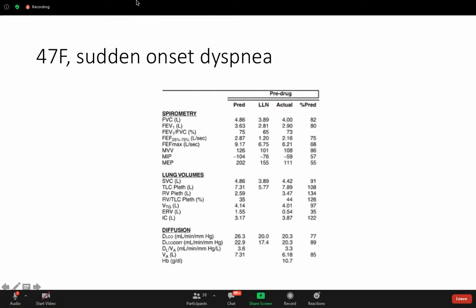Doctor, peace be upon you. And upon you peace. I have a question about the DLCO: if the ratio is normal, why do we look at the corrected one? Yeah, when you have the corrected one, actually use it, because it's corrected for other factors, and those factors are important because they don't have anything to do with the lung. It usually has something else to do, in particular body weight as well as the hemoglobin level. So when you have a corrected one, use it.